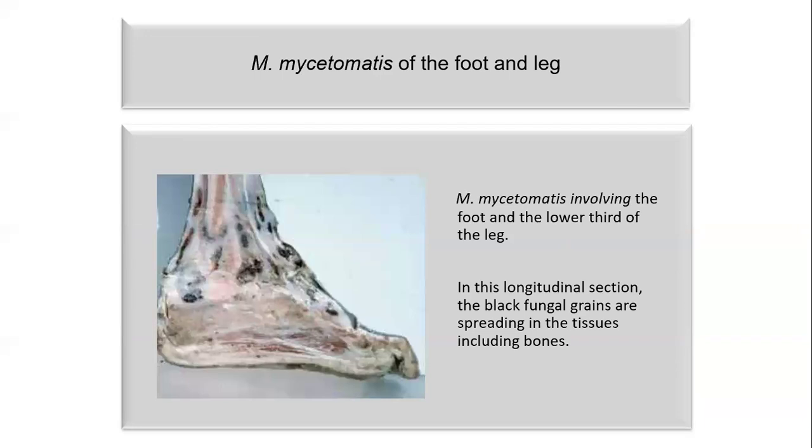This is also a gross specimen of the foot and leg. And it's seen here that the mycetoma is involving the foot and the lower third of the leg. And in this longitudinal section, the black fungal grains are spreading. You can see them, they are spreading in the tissues, including the bones also.